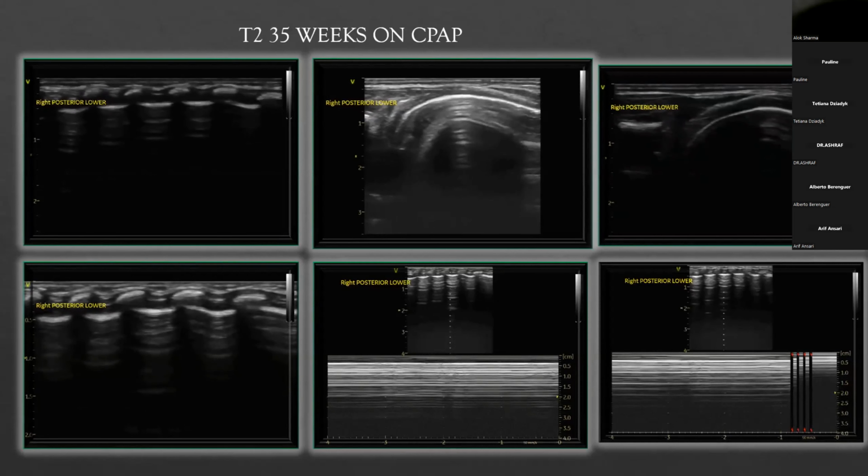So the few things that we recommended: if you're confused and looking at multiple ribs, go into each individual intercostal space and look at sliding in each one, because you might be able to pick up an air bubble. Like you said, you're worried about the middle area maybe not showing sliding, so I would go into each individual intercostal space, doing transverse scans up to down.